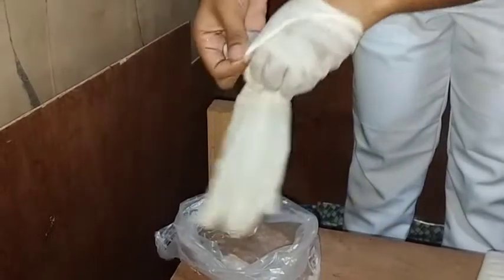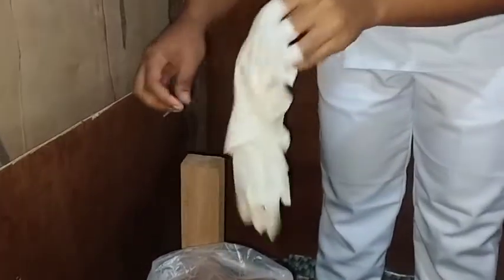Remove and discard gloves. Perform hand hygiene.